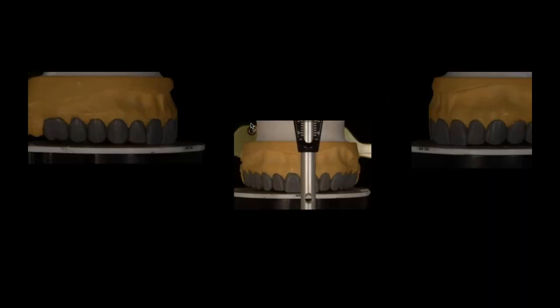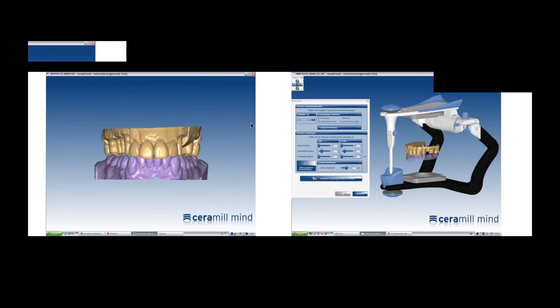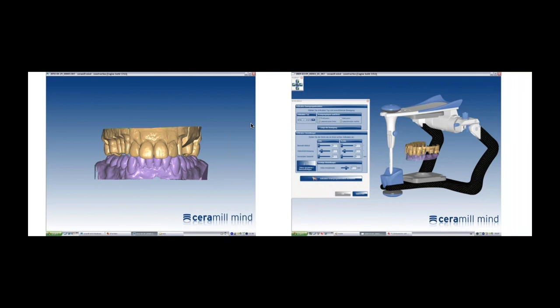So we're going to utilize the horizontal plane, which is very typical for us. We want to make sure we understand where the incisal edge belongs and where the incisal plane belongs. And one of the great things about milling today is that I actually can see all this in my plane or in my scanning process. It's kind of funny. I remember about 7-8 years ago, I was in Austria with Aman, and I was talking to one of the engineers about creating a level plane that they can use in the scanning device. And I think they all looked at me as the dopey American and said, oh, we don't need that. We have everything we need.